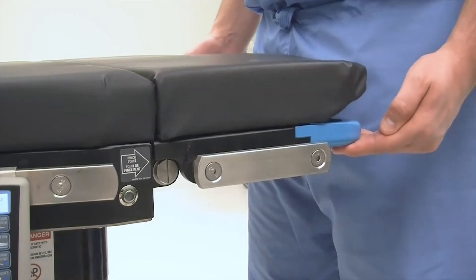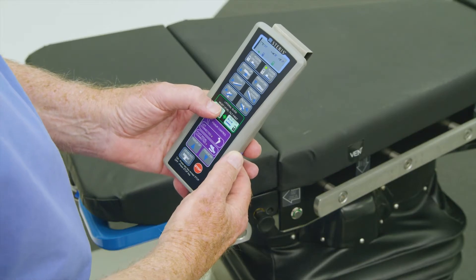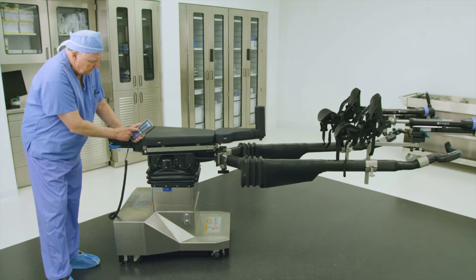First, ensure the head section is level and manually adjust as needed. Next, press the level tilt button on the hand control to ensure that the tabletop is level.